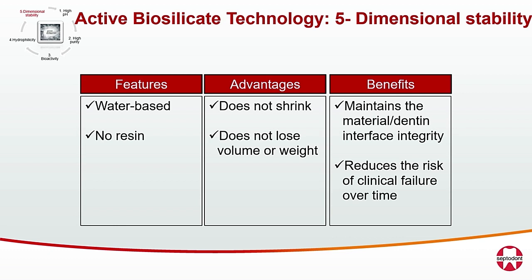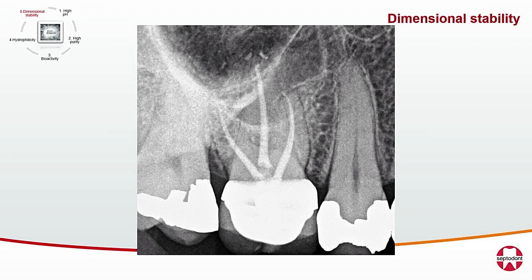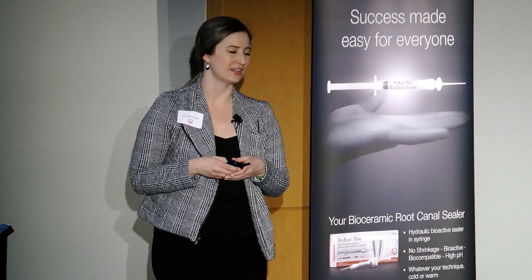Some of the other benefits, including the dimensional stability, are that it's going to create a really strong interface between dentin and the gutta percha. That integrity is fantastic, and it's going to reduce the risk of clinical failure. Here's another cute little forked tongue of a palatal root, but I like knowing that this is going to stay. So this is going to stay sealed.